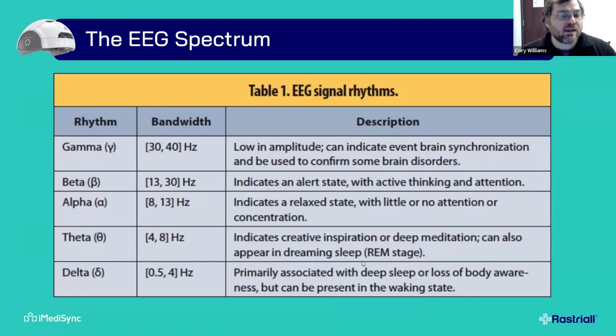Now, when we look at EEG, and some of you may already know this stuff, and if you do, you're welcome for the review, and if you don't, you're welcome for the new information. When we measure EEG, we group waves together based on their function. So what do these waves do? What's their primary function? The slowest is called delta. That's typically 1 to 4 hertz. And a hertz, in case you're curious, is measured in cycles per second. So how many times does that wave go up and down in 1 second?